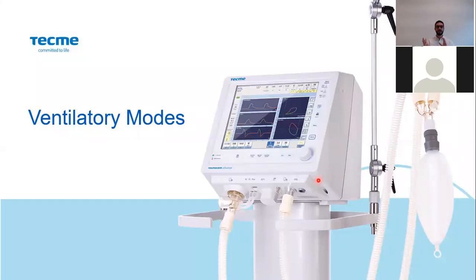The ventilator will control the cycling moment and the PEEP. In a spontaneous or in assist ventilatory mode, the patient will decide when to start an inspiration and when it finishes, by the inspiratory sensitivity and the expiratory sensitivity. Both concepts I'm going to explain better in the ventilatory mode.